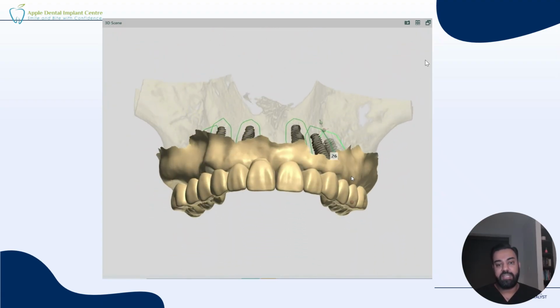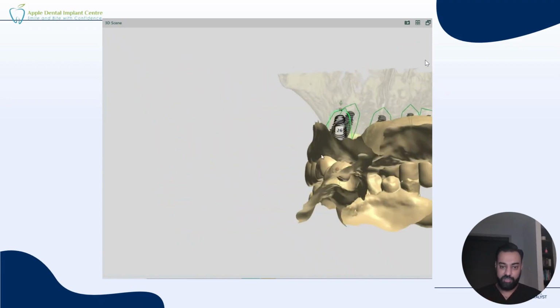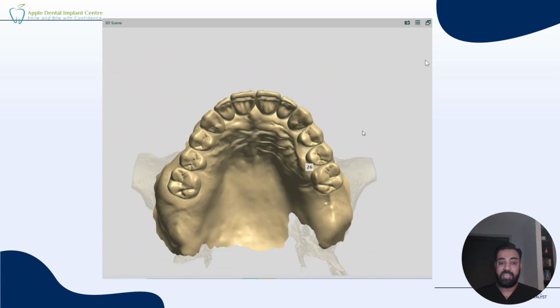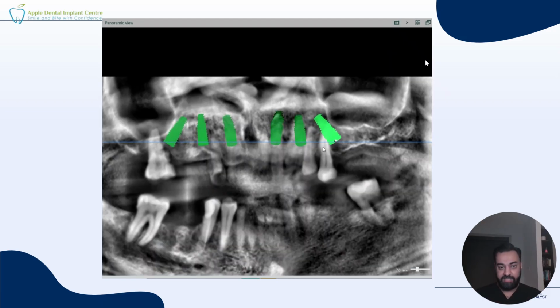We will raise the bite slowly with the first temp. I plan to do a second or a third temp prosthetic as well, and we will gradually open his bite and get his masticatory musculature habituated to it rather than open it up all at the same time and create problems where our prosthesis can fracture. You would notice that my posterior most implants have a steep angle. That is to increase our anterior posterior spread. This is a plan based on 6 implants.